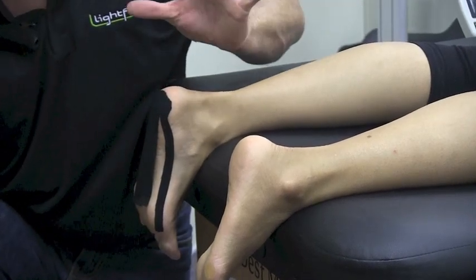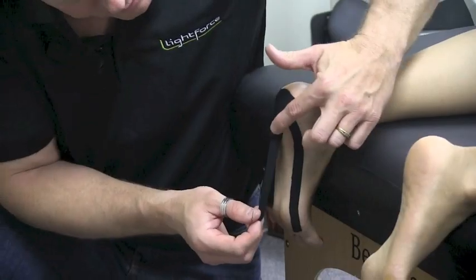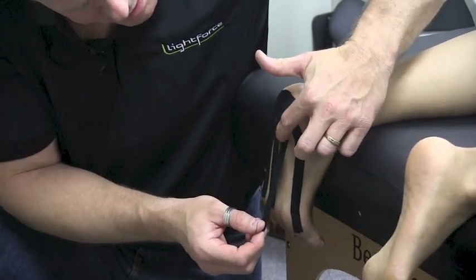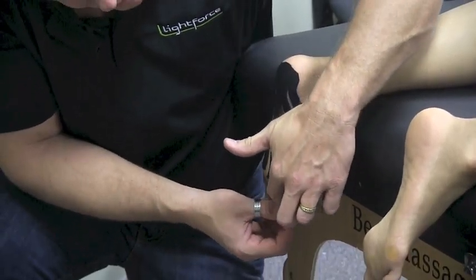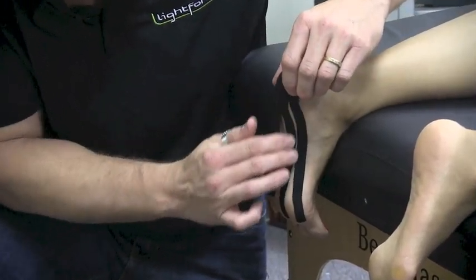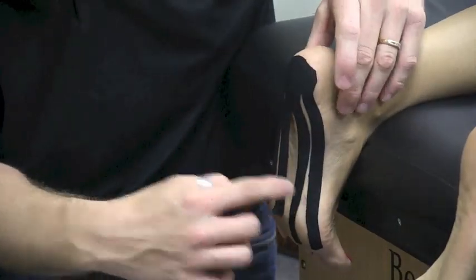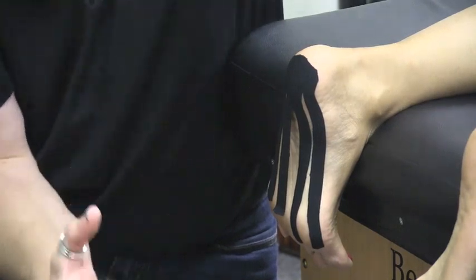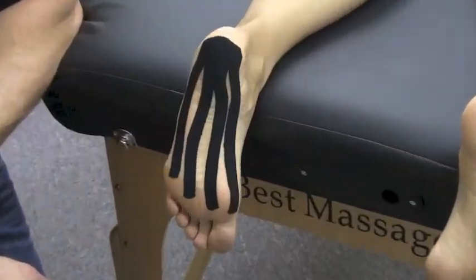Lay the outer edges down first to form your canvas, then lay the center pieces down after. You want spaces between the tape strips — that gives a different lift because of the change in pressure gradient. Where the tape is, there's more lift compared to where there's no tape. That compressive action helps pump swelling and inflammation down.